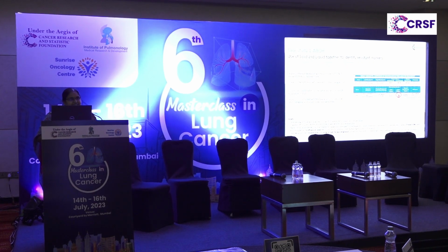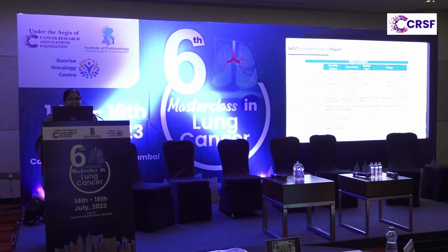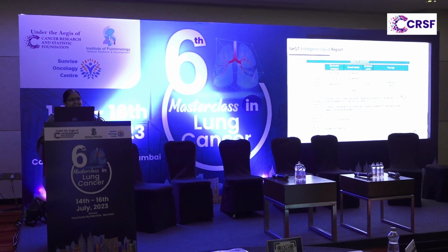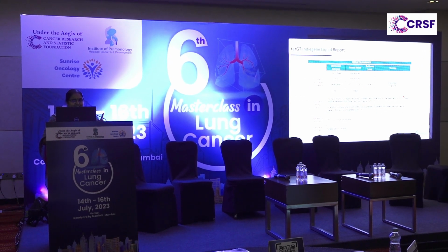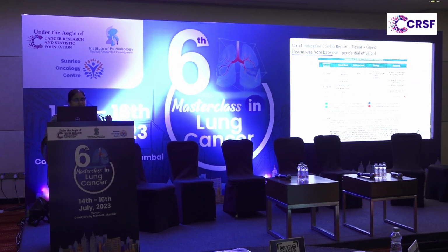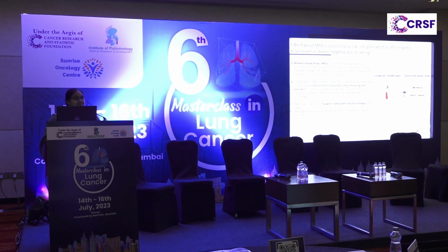So this is a very clear example that you have to look at both tissue and liquid together. Another example: this is a case of 2 drivers. First, the clinician killed the first driver with a ROS1 target. Then after 1 year, we got the slow growing driver, L858R.